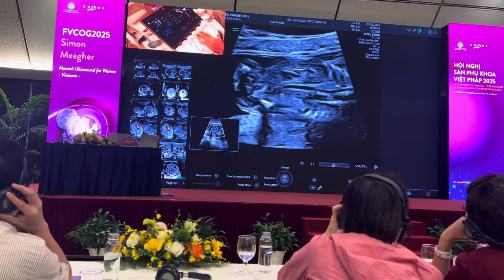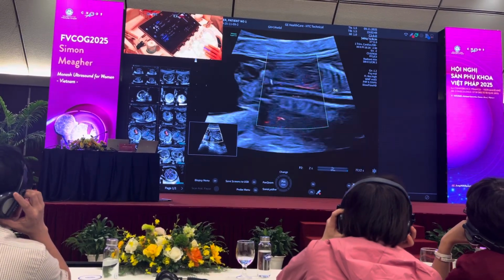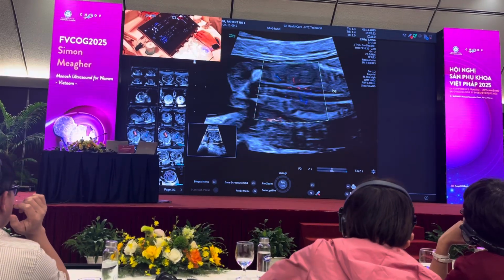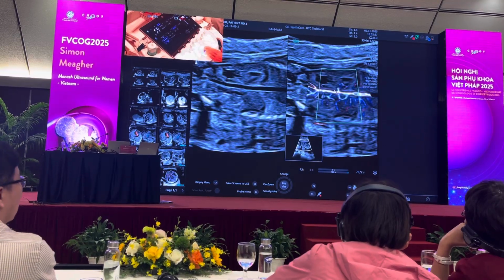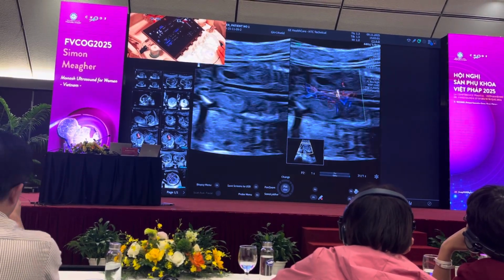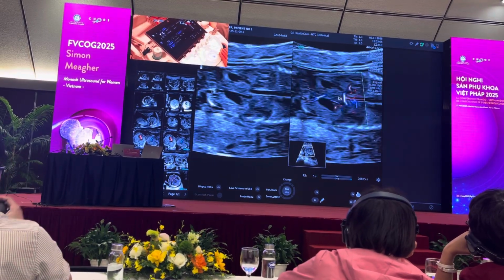So you put on the slow flow, and once I've got slow flow on the arteries, I look to see whether there's a single renal artery or there are double renal arteries supplying the baby's kidneys. You can look at both 2D and in colour, and when you look at this, you'll see not only the renal arteries, but you're also seeing the vertebral arteries supplying each individual vertebrae.